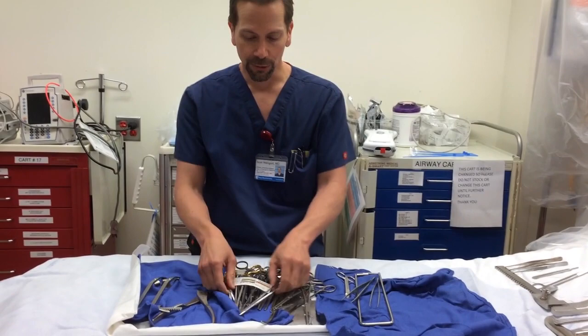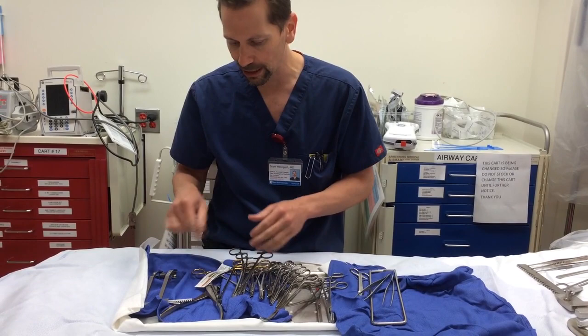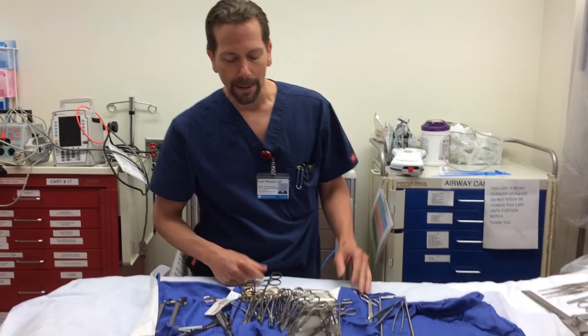Now you want to cut through the pericardium. For that, it would be nice to have a longer, more delicate set of scissors — these are your Metzenbaums. Those would be nice to have in there, though not essential. You can make your Mayos work if you have to, but Metzenbaums are a nice thing to have.